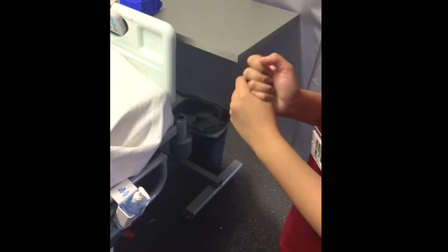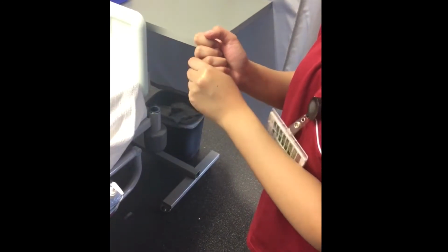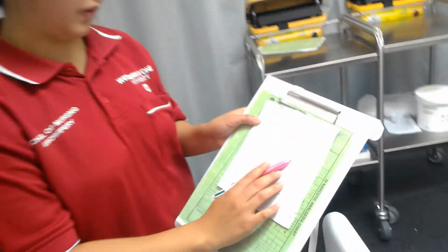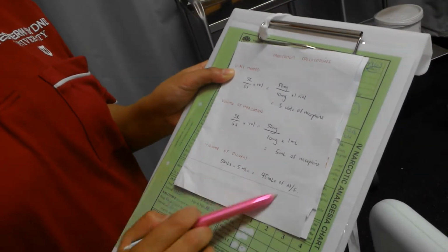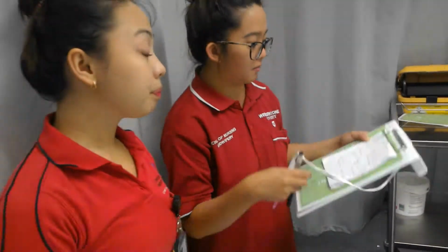Okay, so I've looked at the MIMS and the drug injectable handbook. I'm just going to rub my hands, and I'll calculate how much I'll need to specifically give to Miriam and also gather my equipment. Here's my medication calculation. So from here, I know that the vials needed is 5 vials of morphine. The volume of medication is 5 mils of morphine, and the volume of diluent, which is normal saline, I'll be drawing up 45 mils to make up the total of 50 mils. All right. Yep, I'll just gather my equipment now.